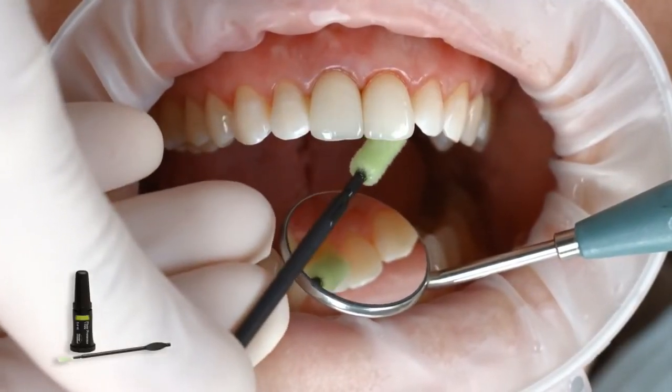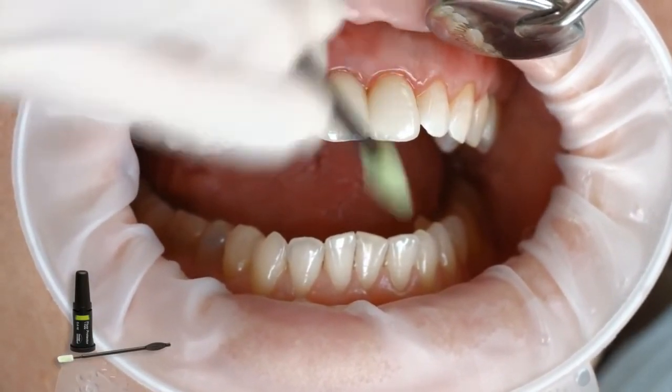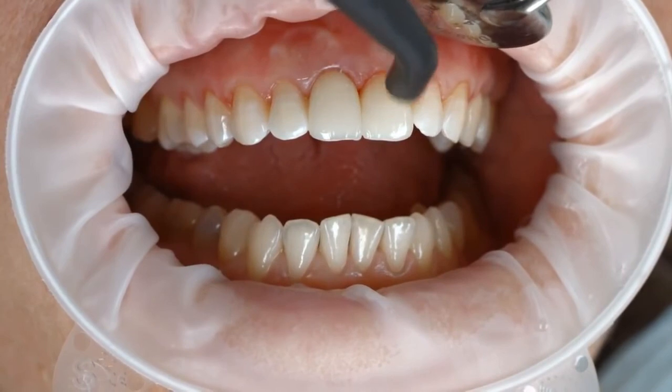As a final step, apply a thin layer of Fluor Protector S with a Vivabrush or a conventional brush. Use the air syringe to disperse and dry the varnish.